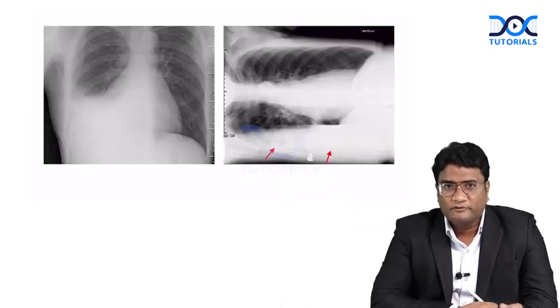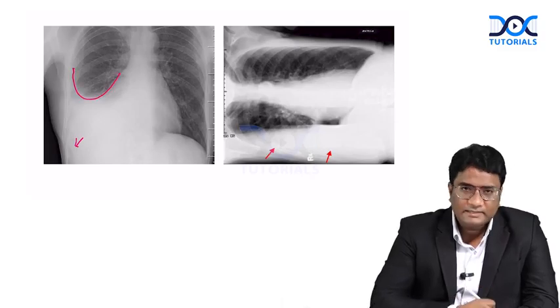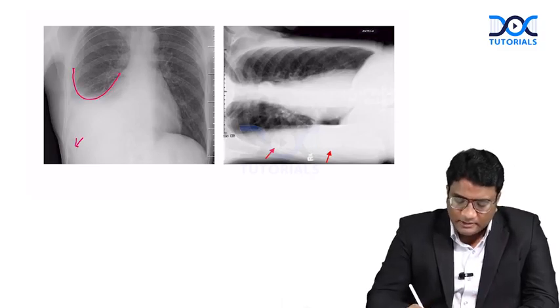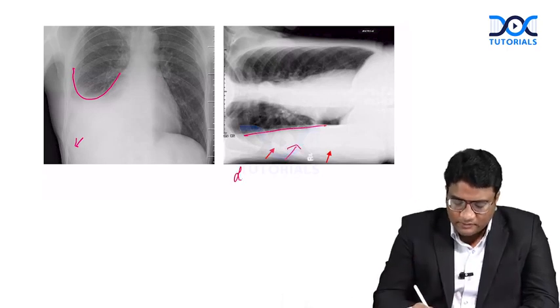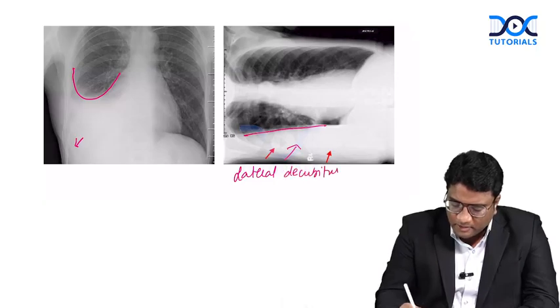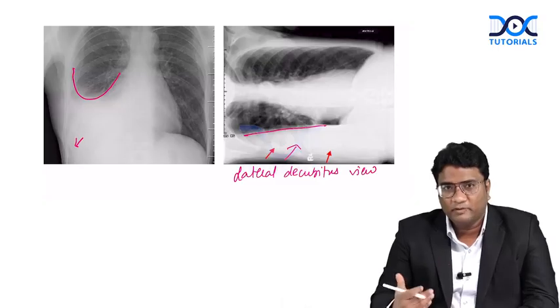And this is how pleural effusion would appear. You will see obliteration of the CP angle, meniscus sign and Ellis curve. When you go in a lateral decubitus view, you will see this layering of a free-flowing effusion. So you see that layering in a lateral decubitus view. The best X-ray view to look at small pleural effusions is a lateral decubitus view. So in the X-ray, if you want to see the pleural fluid better, you will use a lateral decubitus view.